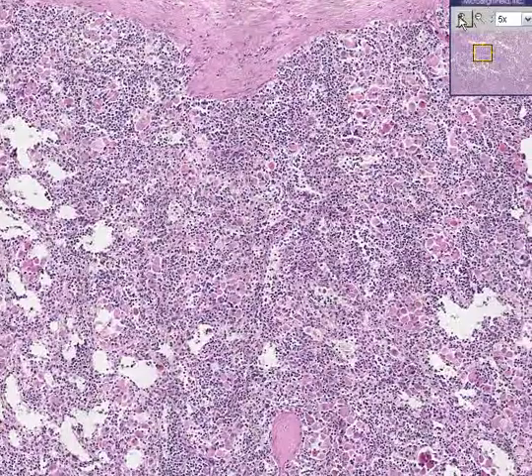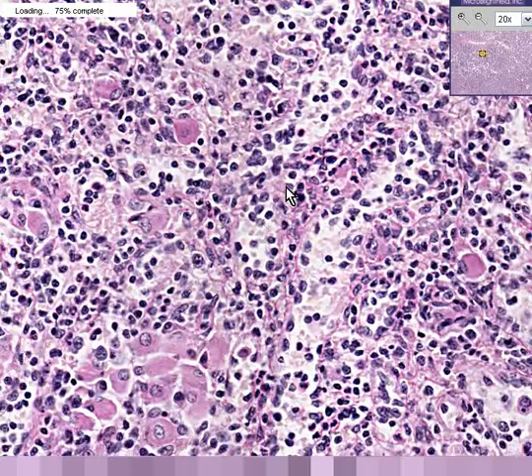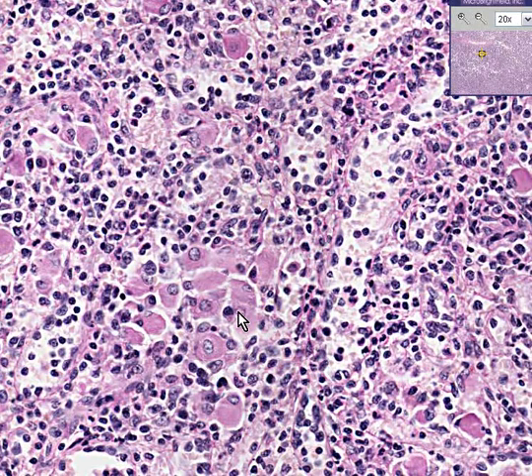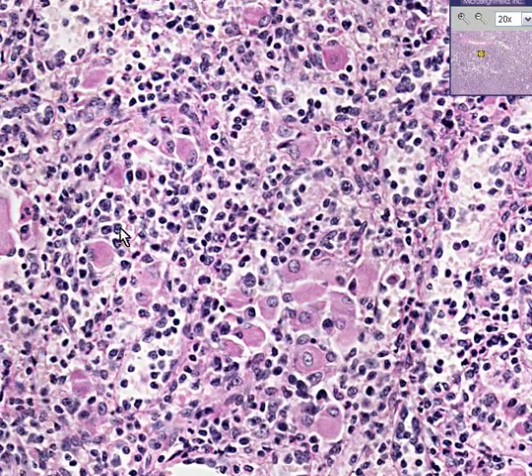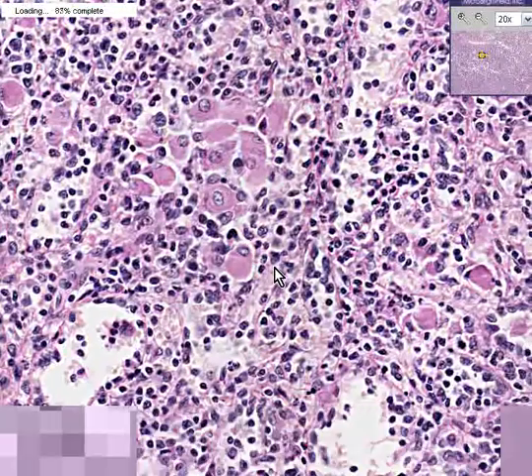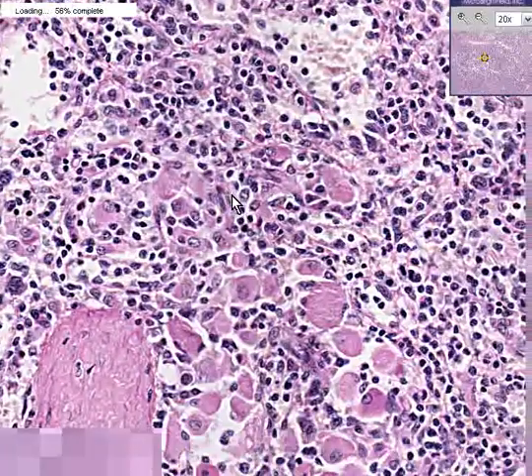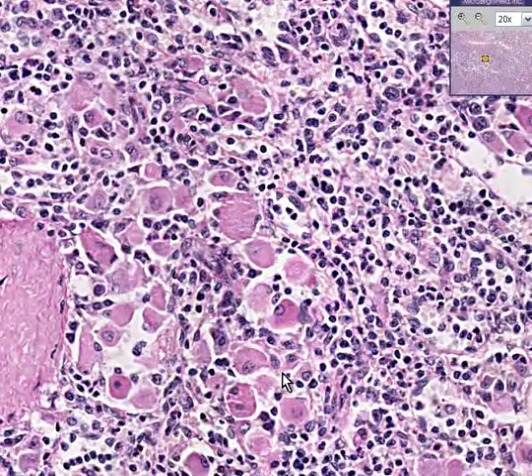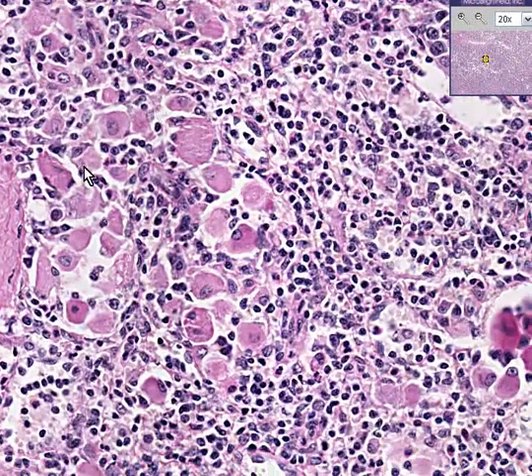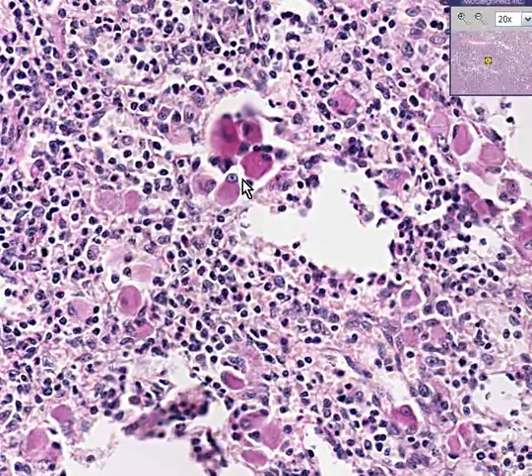But in addition, what is wrong with this spleen? Well, if you've looked at a lot of spleens, the first thing you'll notice is that all of these cells here, all these pink cells with abundant fuzzy cytoplasm, you normally shouldn't see in the spleen. Sure, occasionally you could see some plump macrophages chewing up all the things they're supposed to chew up, but this spleen is enlarged chiefly due to the presence of these foamy histiocytes or macrophages being all over the place. These are classical Gaucher's cells.